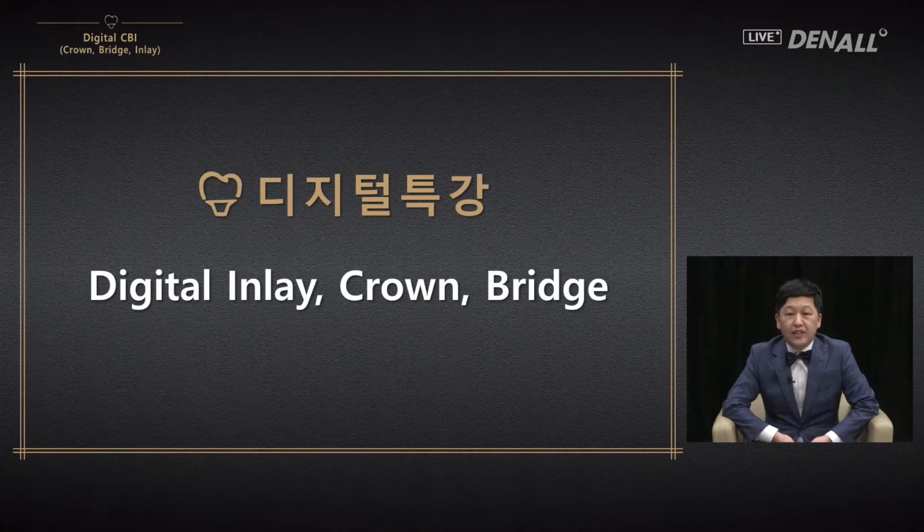Today's lecture is Digital CBI, Crown Bridge Inlay. And I slightly altered the order of the names: Digital Inlay, Crown, and Bridge. The reason I changed it is because when we first learn digital technology, the easiest thing we can do is inlay, and once you master inlay, you can do crown and then move on to bridge.